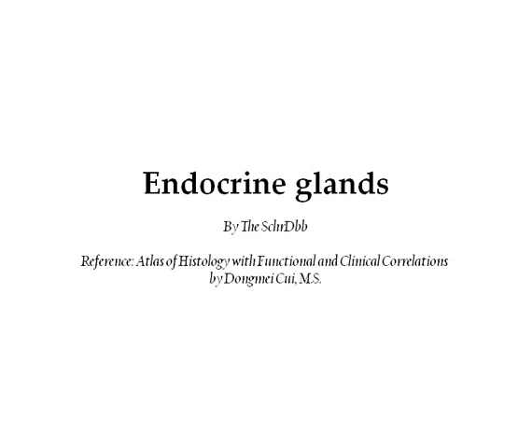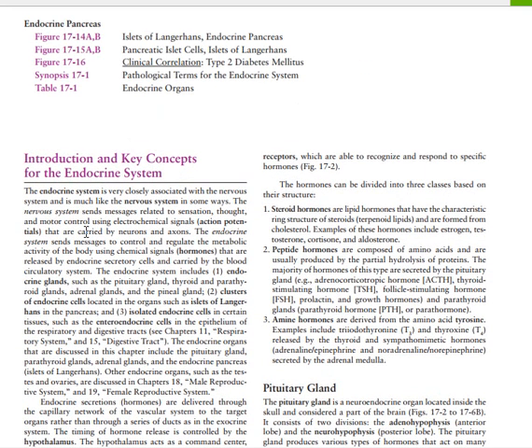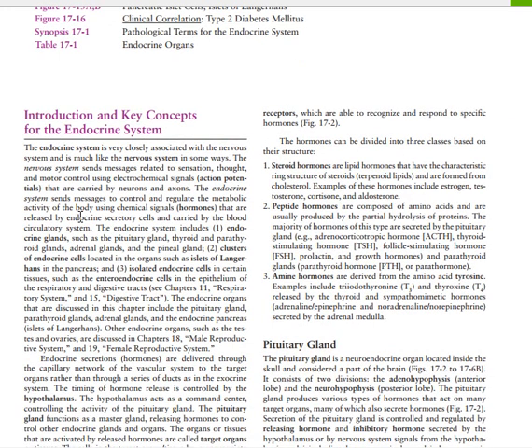This is the endocrine gland histology tutorial, with reference to Atlas of Histology: Function and Clinical Correlation by Dongmei Cui. So we are going to start here with the introduction of the endocrine system.